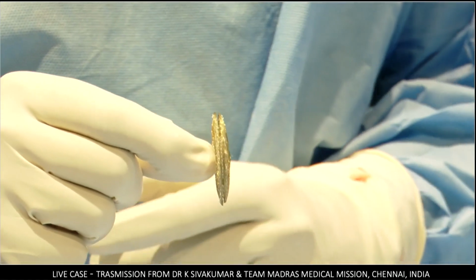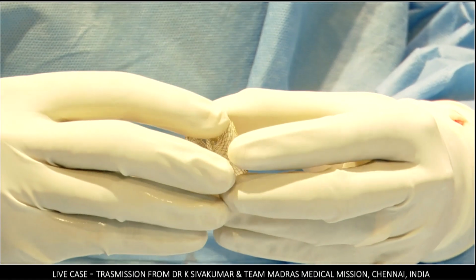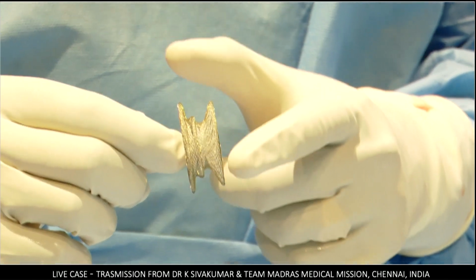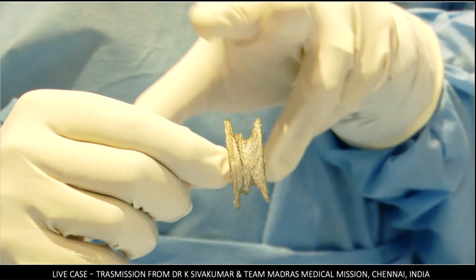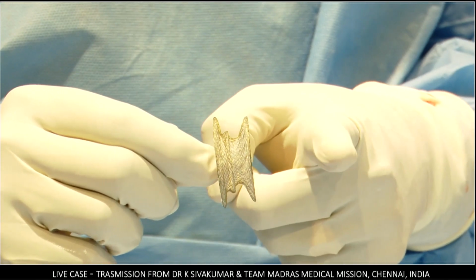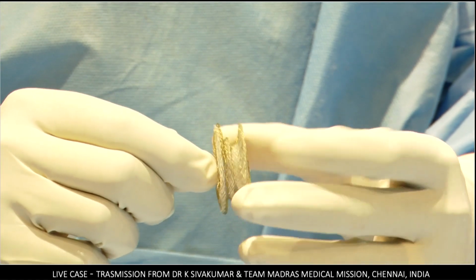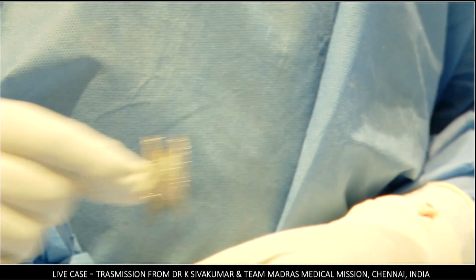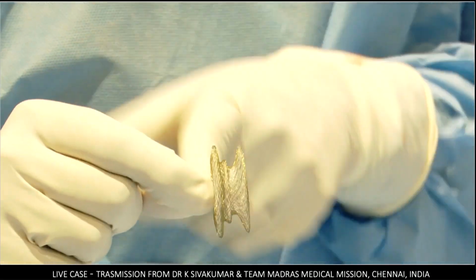Now, since I'm handling the device for the first time, I'm appreciating that the device is a little softer. It's quite soft compared to any other nitinol products that we have used. But whenever I create a concavity on the left atrial disc, the two discs separate out. And this separation is quite consistent. Each time I press the two edges, it reforms. But if for some reason I get the left atrial disc a little concave, that means suppose I have to pull the device, and if I get it concave, the device has got this memory.